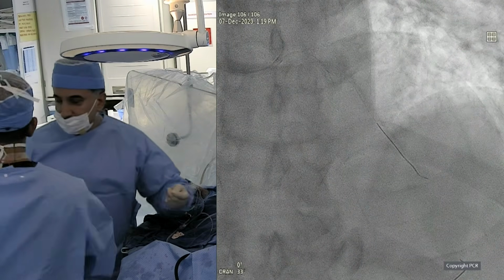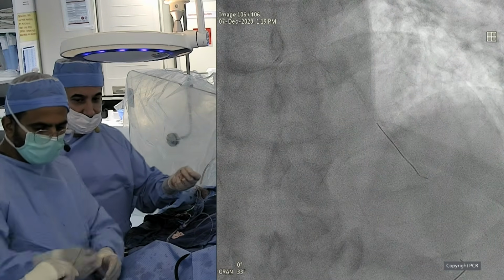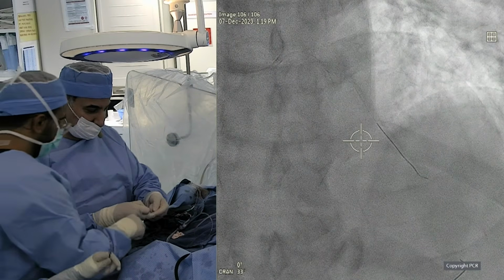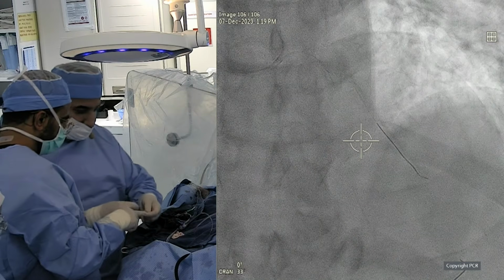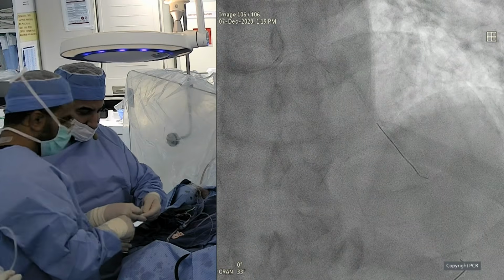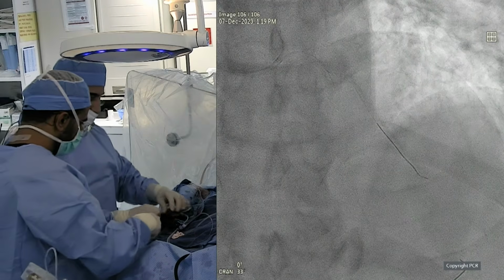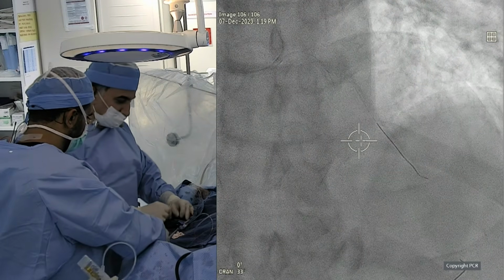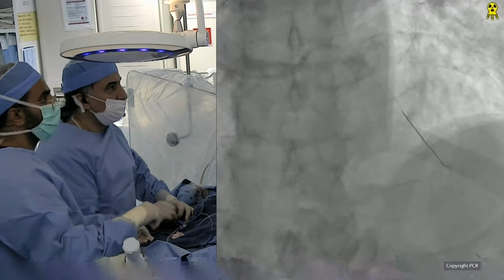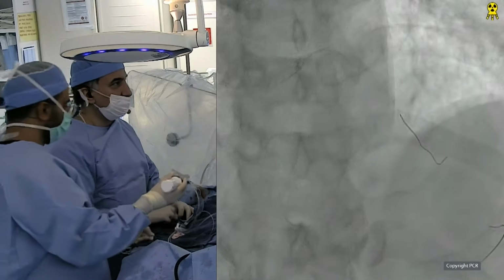There's still a lot of work. We haven't talked about the distal part, because there is still a lot going on up to the apex, where we normally wouldn't want stents. What would be your strategy there for the distal part of the vessel, where there is further disease? At home where I work, the surgeons always say, do not put stents there because we might come into this region. Well, if you mean the very apical LAD, it's quite small. I think in my eye at least it's less than 2 millimeters. So I will avoid doing anything in there.